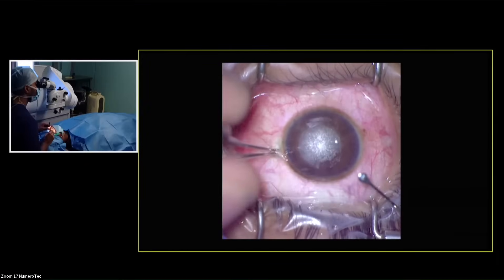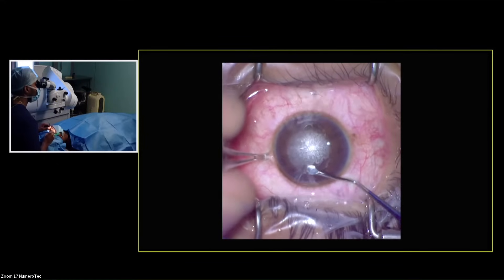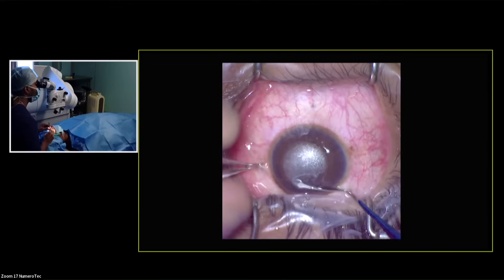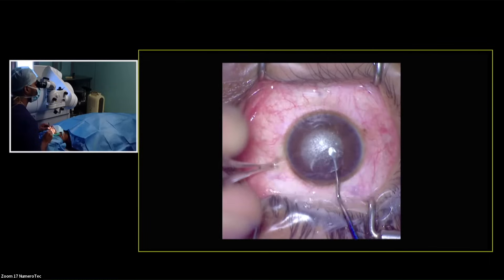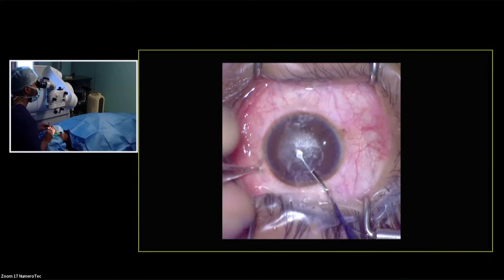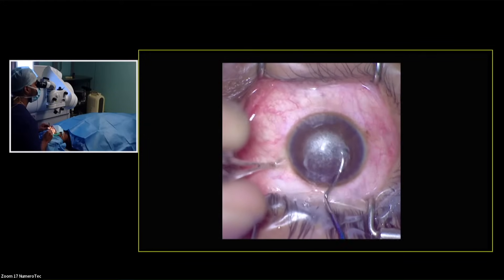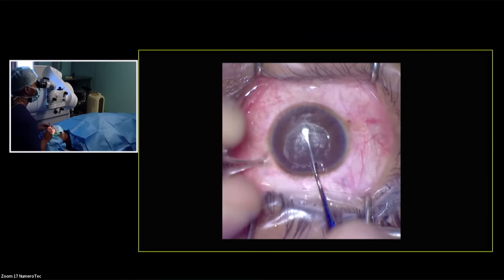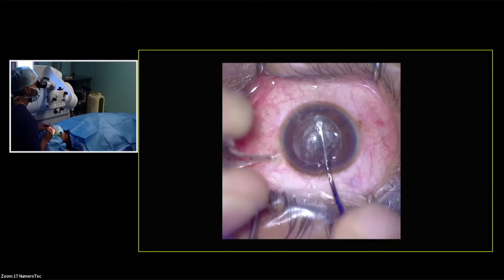This is quite important — I'm avoiding that inferior entry. Now I'm lifting up on the cap incision. Then just move like a windshield wiper. Don't try to go all the way to the end of the cap and do a dissection in one sweep. If you take smaller bites of the tissue for dissection, it goes much smoother and easier. Take your time, dissect it up to the very end. That's the superior dissection.